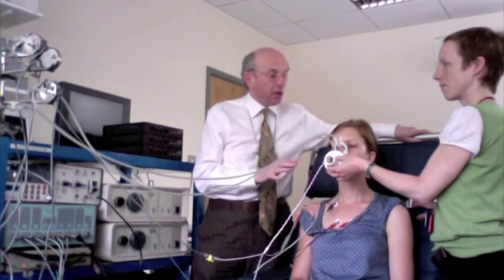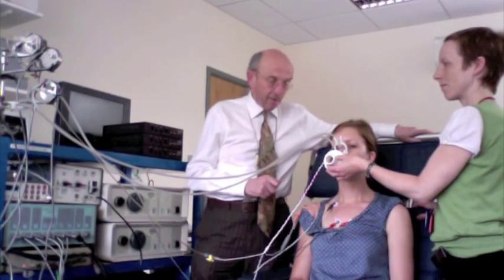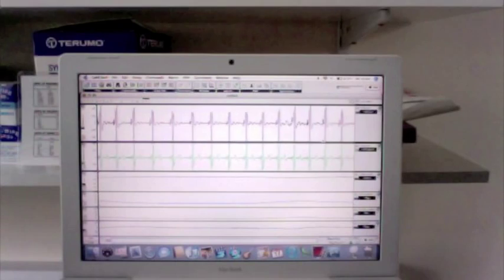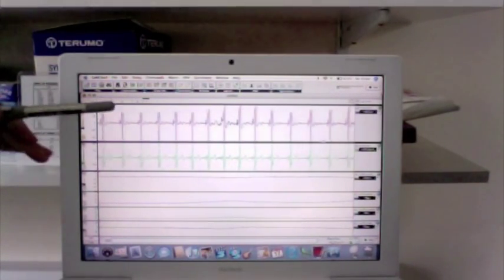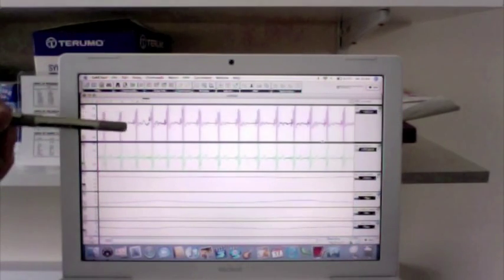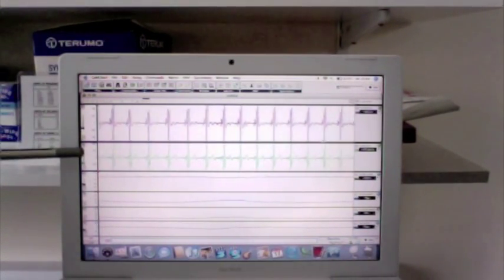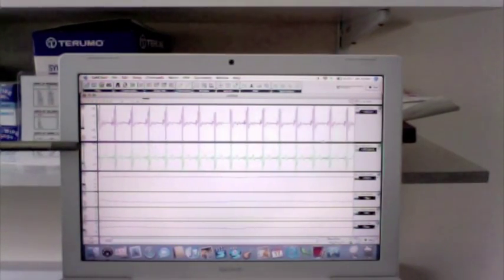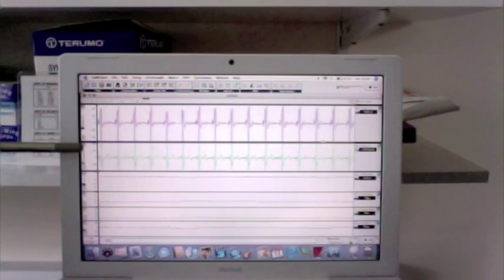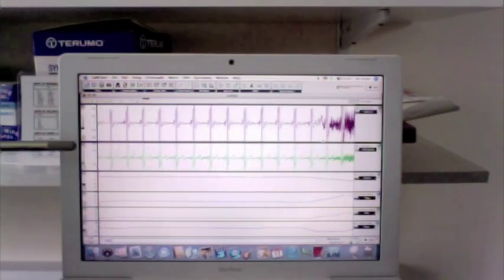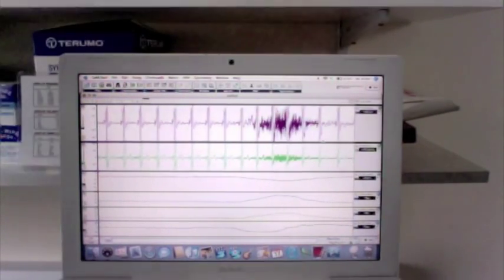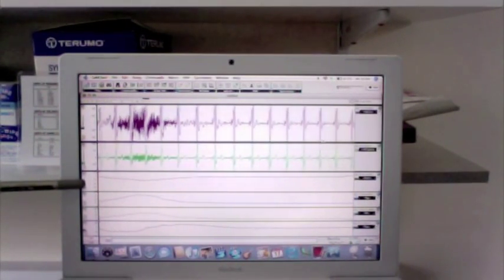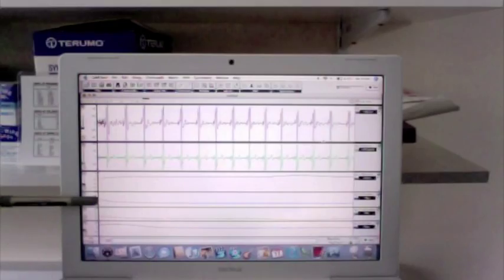Here we see a screenshot showing the EMG and the pressures. The top trace is the EMG of the diaphragm — the big signals are the ECG — and here's the parasternal EMG. If I ask the subject to take a big breath in, you can see the EMG activity much more obviously. Below we have the pressure traces: the esophageal pressure, the gastric pressure, and the transdiaphragmatic pressure.